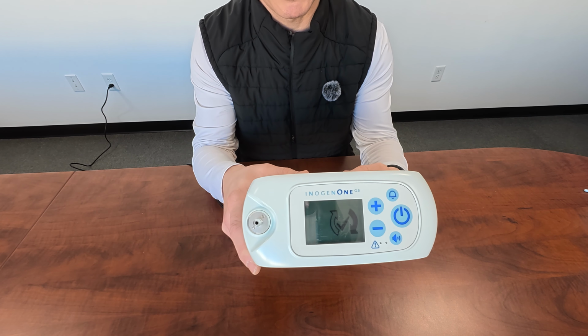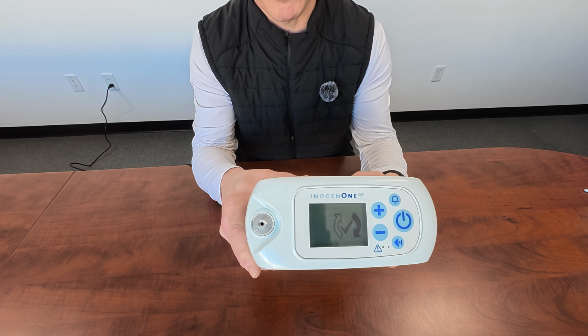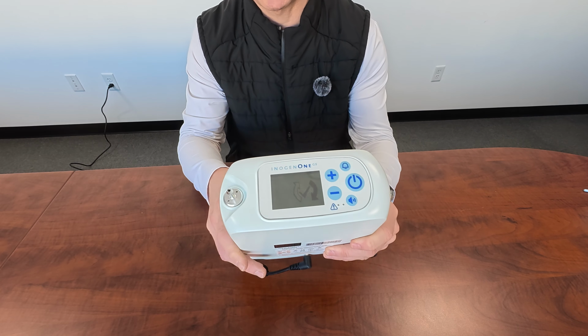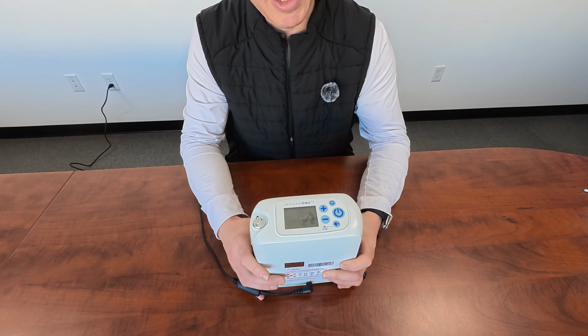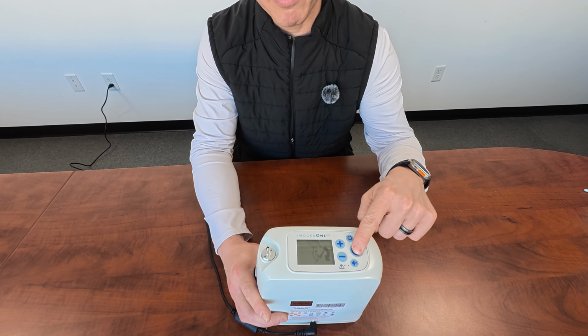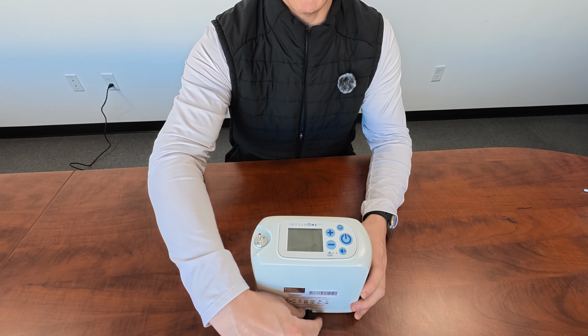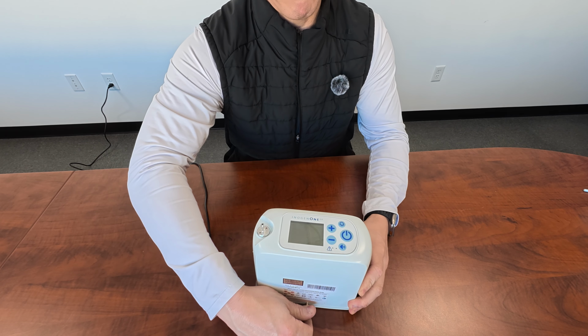And it might be a little hard to see with the screen dim there, but you should see a check mark on the display now. So that lets us know the G5 accepted the column reset. And then from there, we can just hit the power button. So that clears it off the display. And then we can go ahead and unplug your G5.